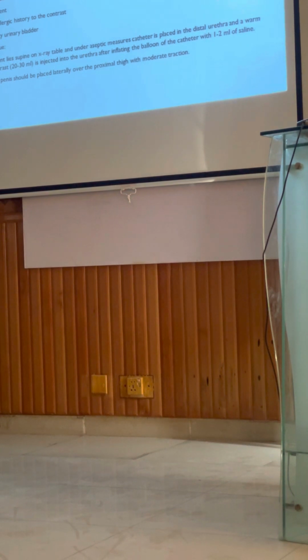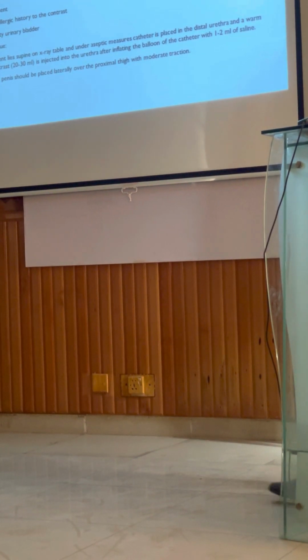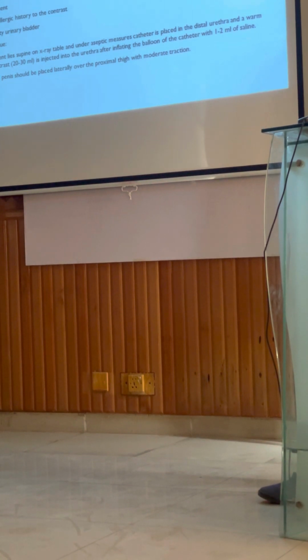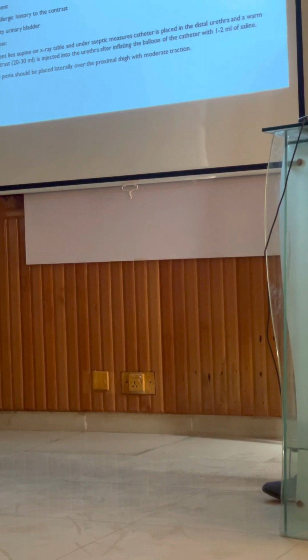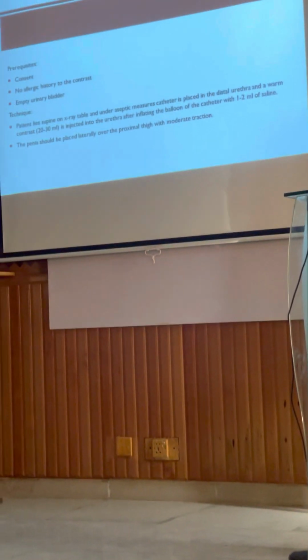Now, what are the prerequisites of retrograde urethrogram? We have to take informed consent. So the entire procedure should be explained to the patient, and there should be no allergic history to the contrast.